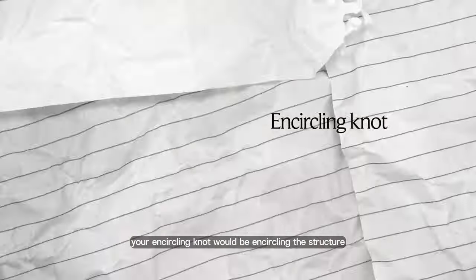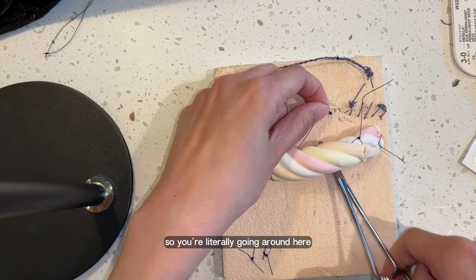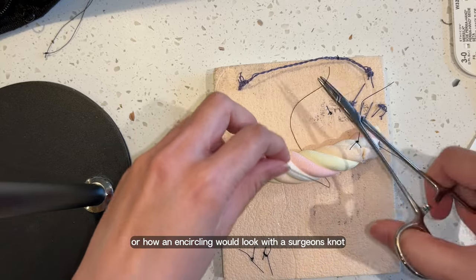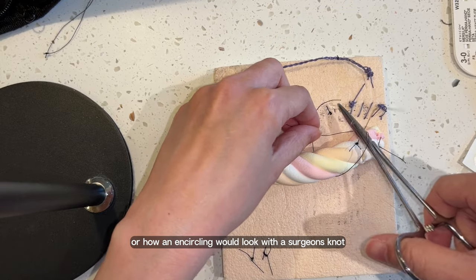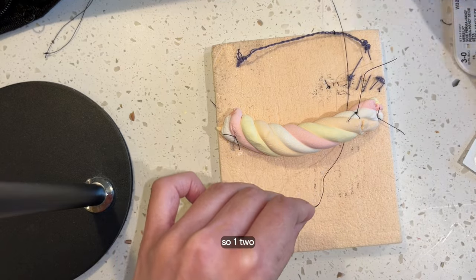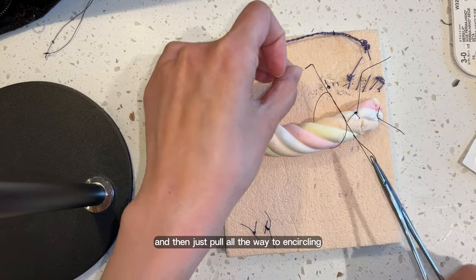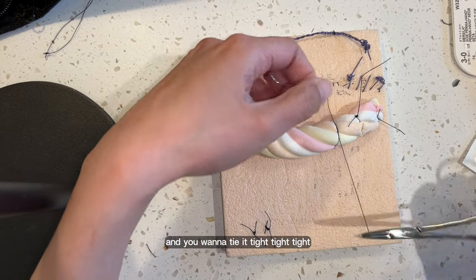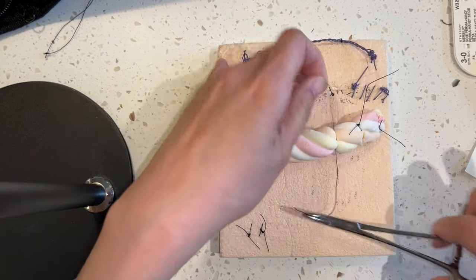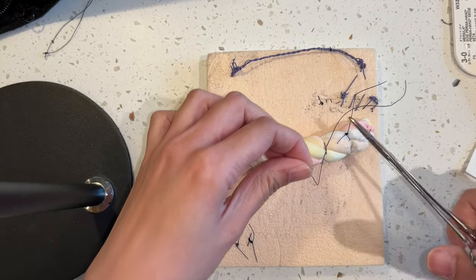Your encircling knot would be encircling the structure — literally going around here. You can do a Miller's again, or show how an encircling looks with a surgeon's knot. Go one, two — two times around the needle holder or hemostat in my case — and then just pull all the way to encircle. You want to tie it tight, nice and close. Then do the same and just do square knots.